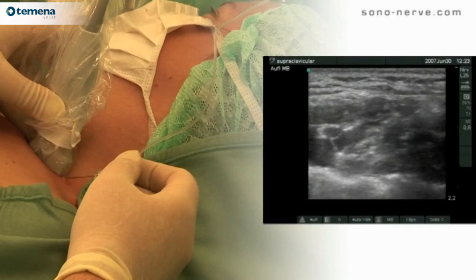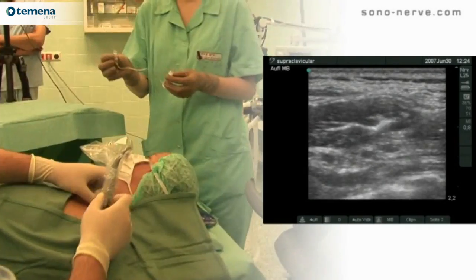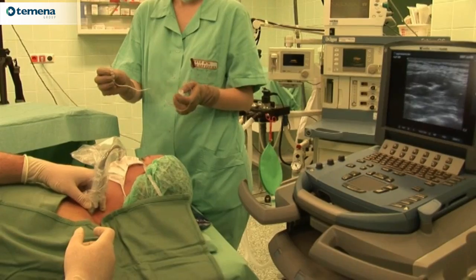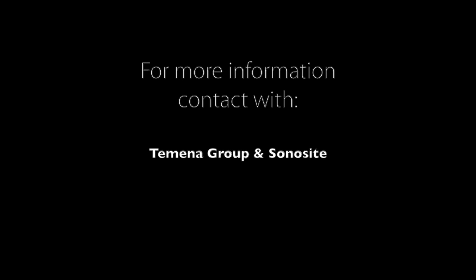Because of the close anatomical proximity of the subclavian artery and the pleura, we strongly recommend that this block is only performed under ultrasonographic control.